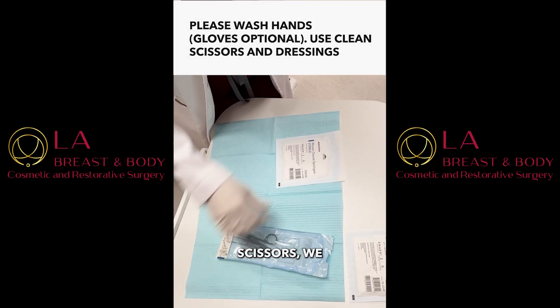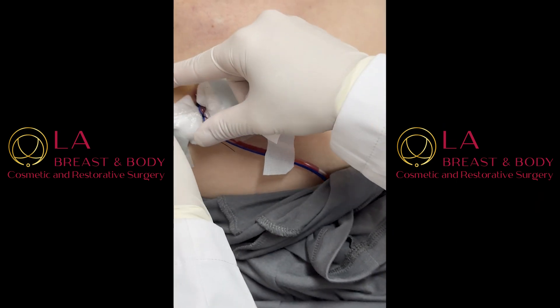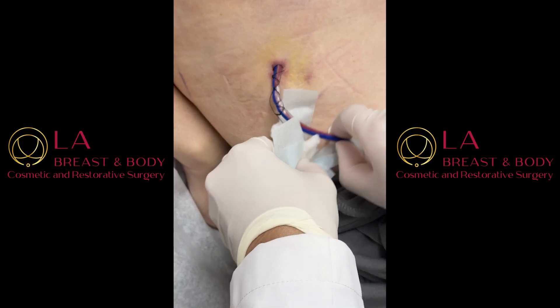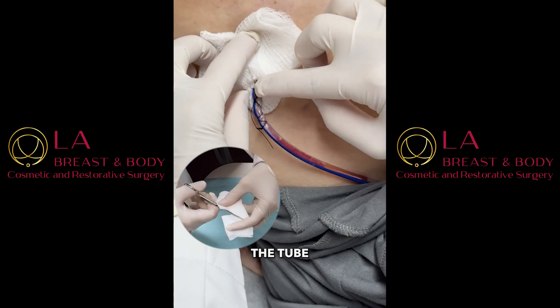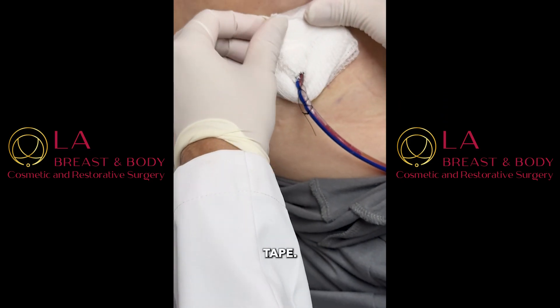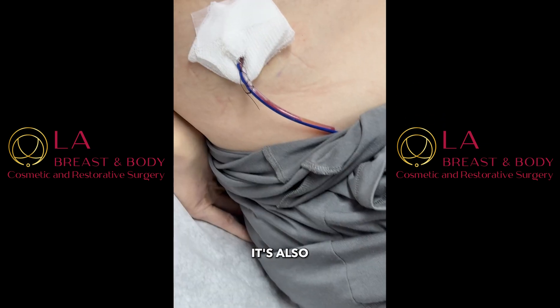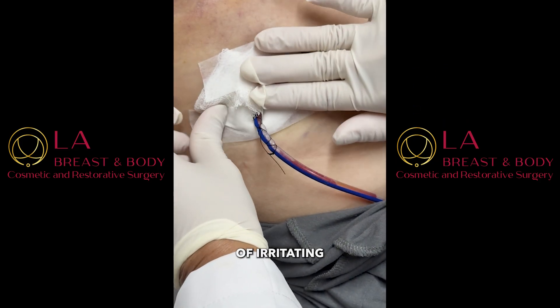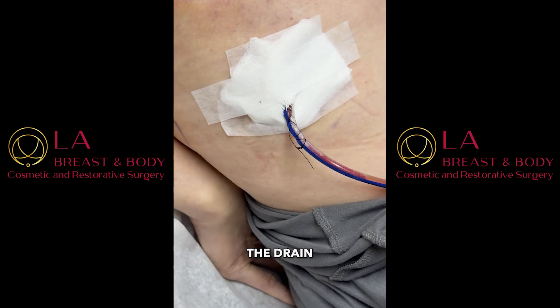So these are the things we need: scissors, gauze, and tape. I'm just going to take off the old dressing and clean this a little bit. The important thing is that the tube is resting — it's like offering the tube support where it comes out of the patient's skin. Then I'm going to put tape. This is paper tape; we call it micropore. It's not as strong as some other tapes but it's more gentle on the skin, especially if you have a drain for a long time. The point is to offset the tension on where the drain exits the skin.